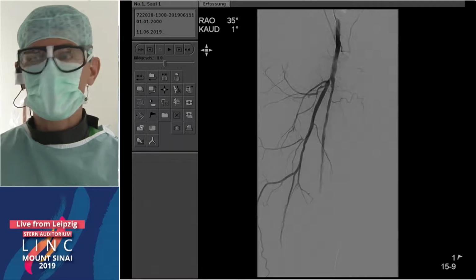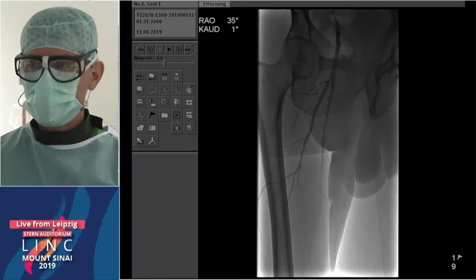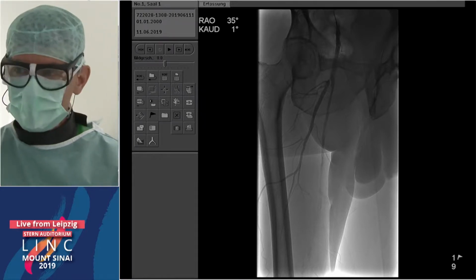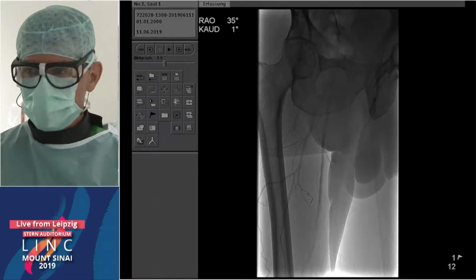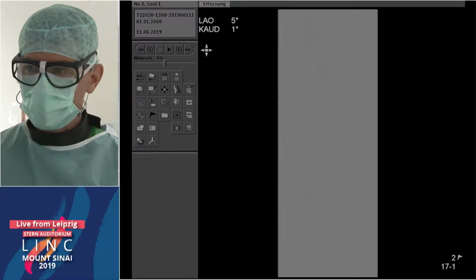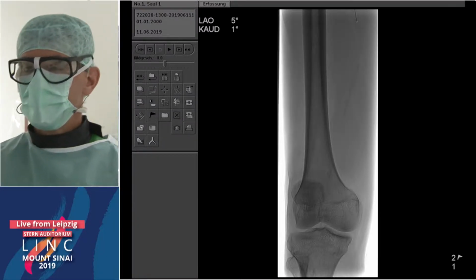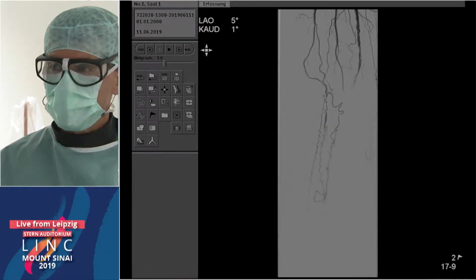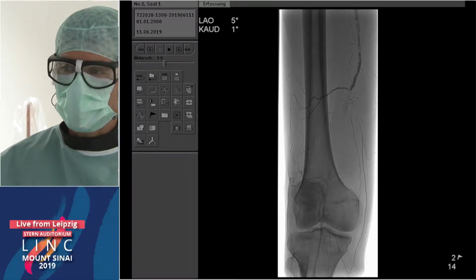Okay, so here once again the angio coming from crossover. You can see already relatively small arteries. He's in fact really also a very small man, and I would say maybe 4 millimeter arteries. Proximal maybe not so much calcified, distal somewhat more calcified, as you can see here. And this is also where the occlusion is. So it's a very distal occlusion going into nearly P2 segment.